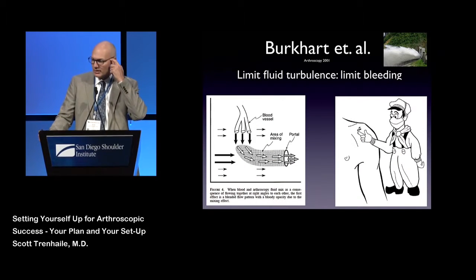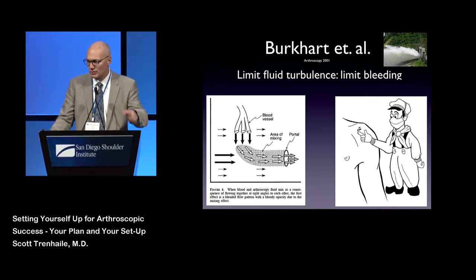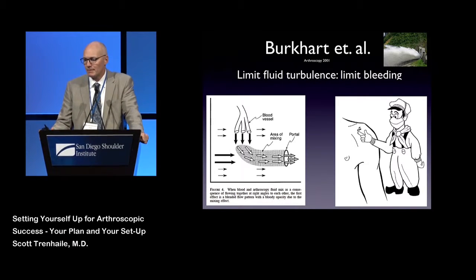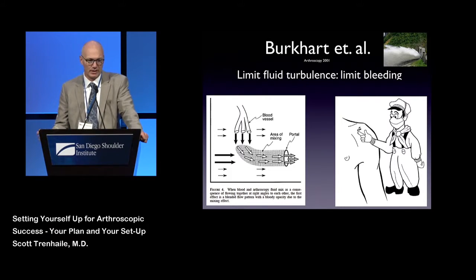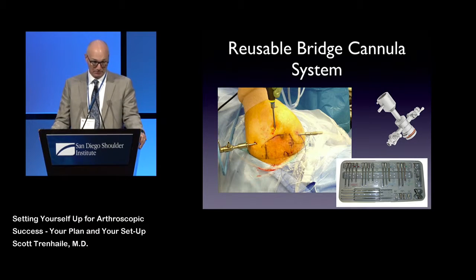And this is an article that I've talked about a lot because I think there's a lot of truth in this. Steve Burkhart talks about the Bernoulli effect, and that effect is when you're standing in the shower and the water rushes by and the shower curtain sticks to your leg. Basically, if you've got a leak and you don't plug that leak with a cannula of some type, the high velocity of flow will actually draw blood into your field of view and then churn up and create a very murky environment to operate. And so if you plug that hole with a cannula, you can do yourself quite a bit of good.